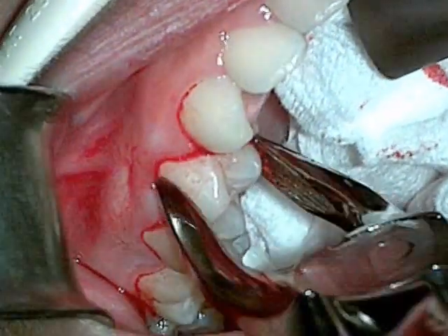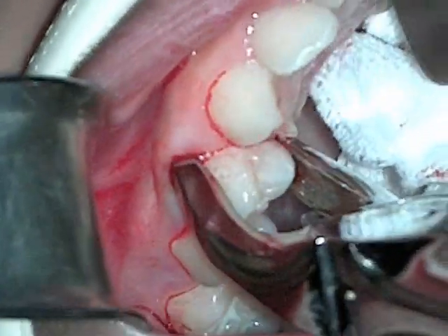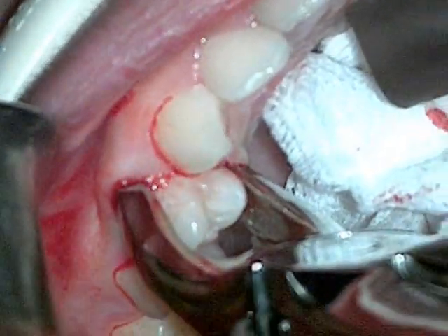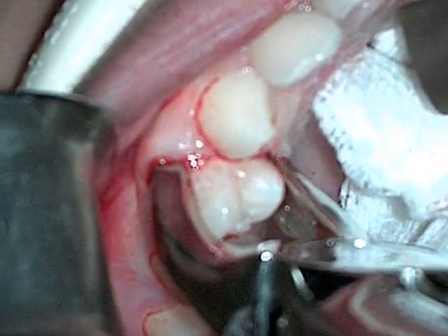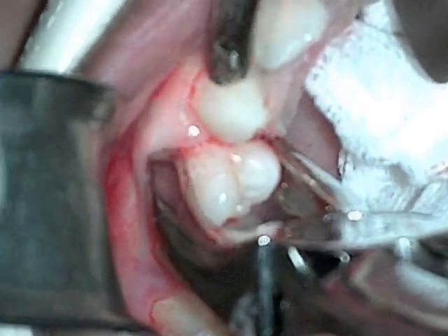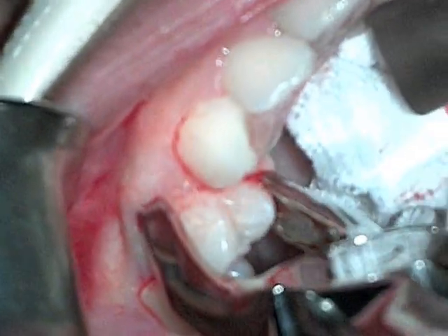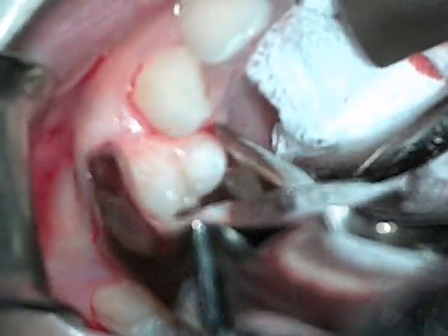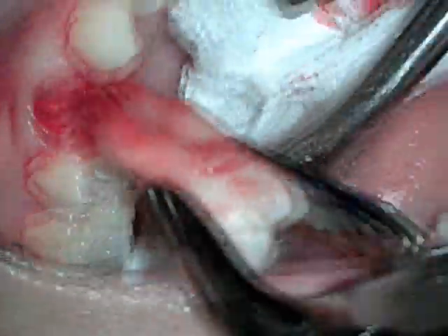So back again with the apical retention forcep, and we're going to luxate the tooth to the buccal and expand the bone, back to the palatal, back out to the buccal again, give a little bit of a rotation or figure eight movement at the same time, and this is going to further expand the alveolus until you feel those periodontal ligament fibers just give way, and then the tooth will become more and more mobile, and gently just lift the tooth right out of the socket.